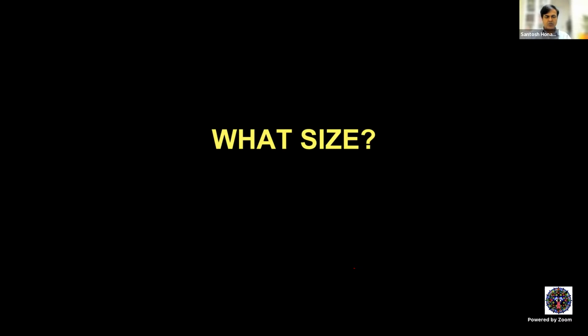The next question is what size? Tithi, can you answer this question? What size? Subhav started off once, so we'll come back to the same question. What size of implant? So usually the axial length minus 2 mm is the size which we choose. Axial length of which eye? So of the enucleated eye.